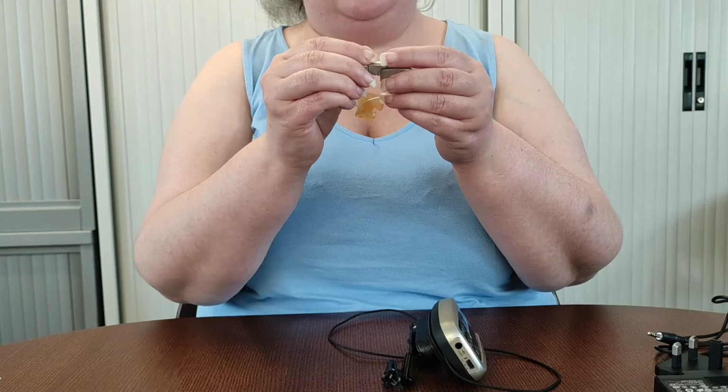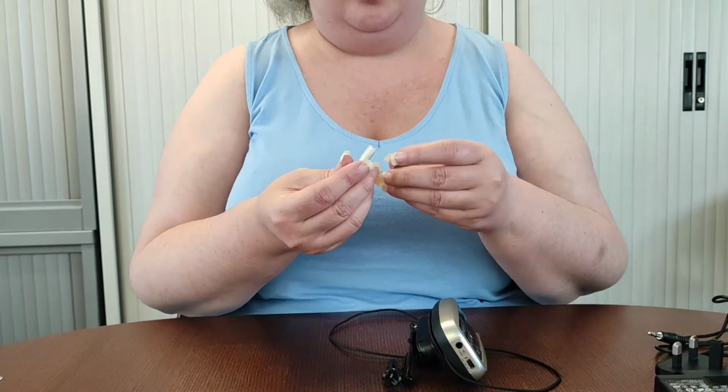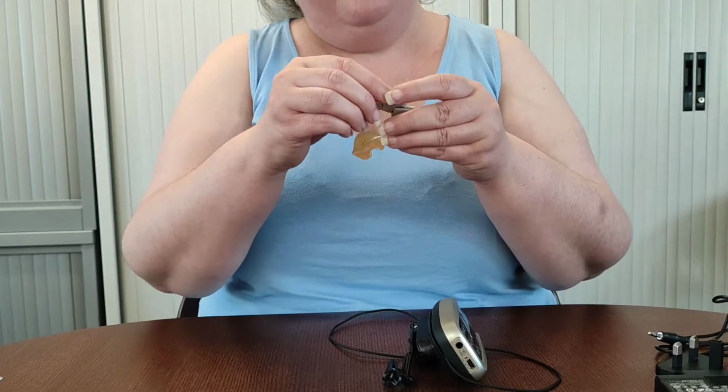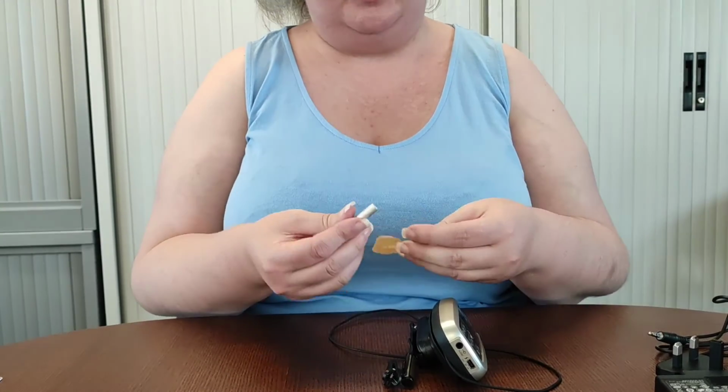So this will also then slide on to the hearing aid. Again, it needs to be flush. If it isn't slid on and flush, again you might have issues with connecting.